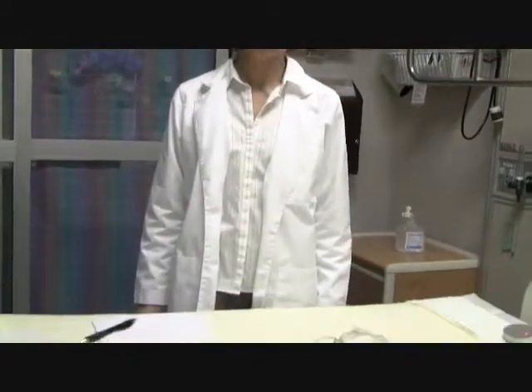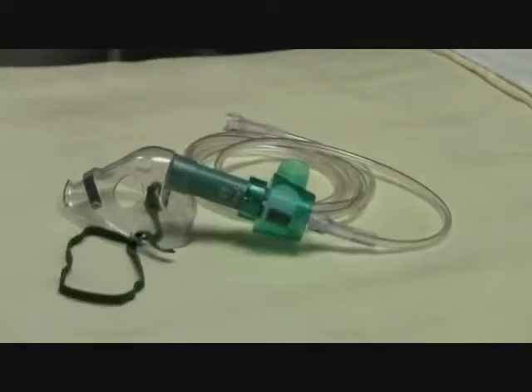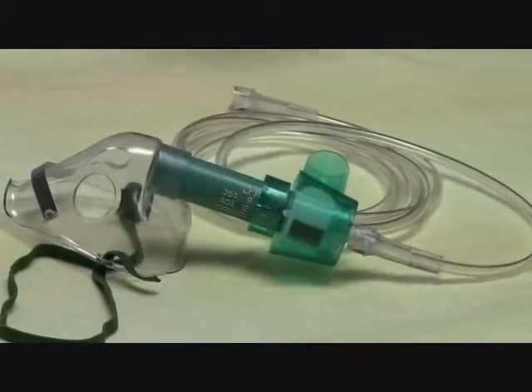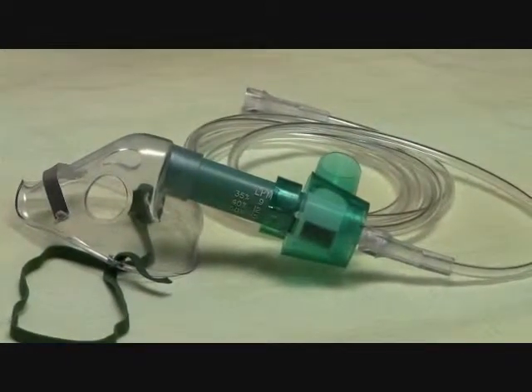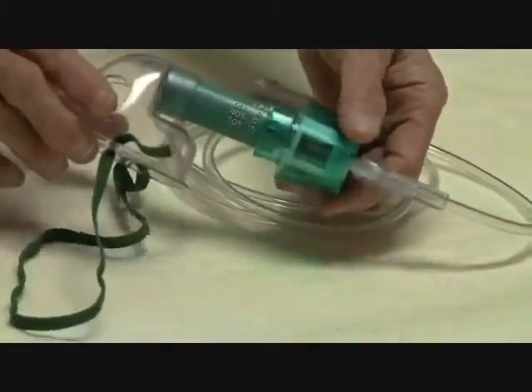Another device we're going to discuss is the Venturi mask, often referred to as the Venti mask in a hospital setting. The Venturi mask is a combination nasal cannula simple mask, as it can deliver oxygen from FiO2 from 24 to 50%. The advantage of a Venti mask is that it will deliver a fixed rate of oxygen. For example, if the MD does not want the patient to get a high rate of oxygen, like a non-rebreather would give 70%, he might order 35% FiO2.